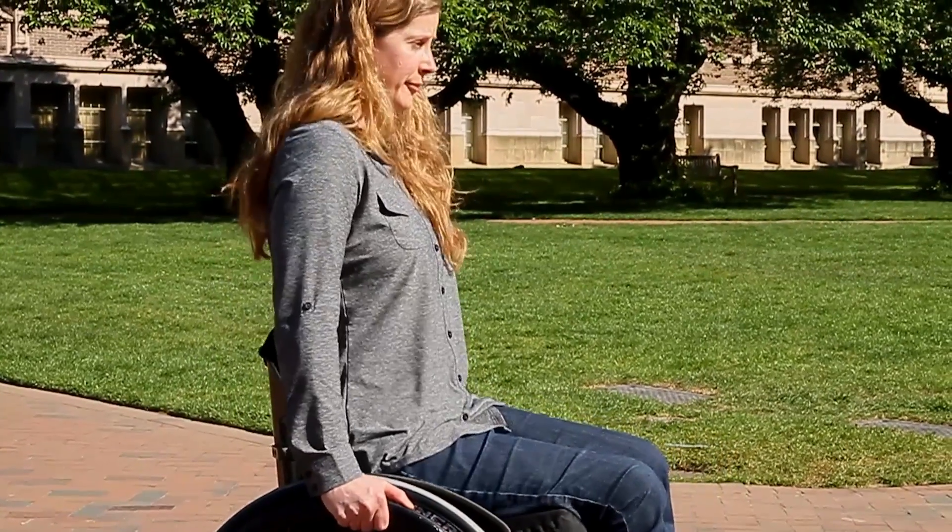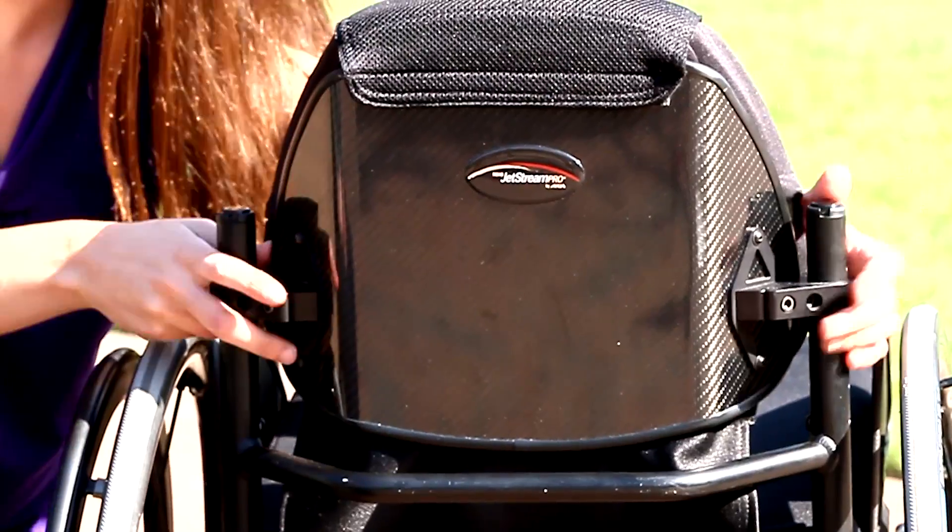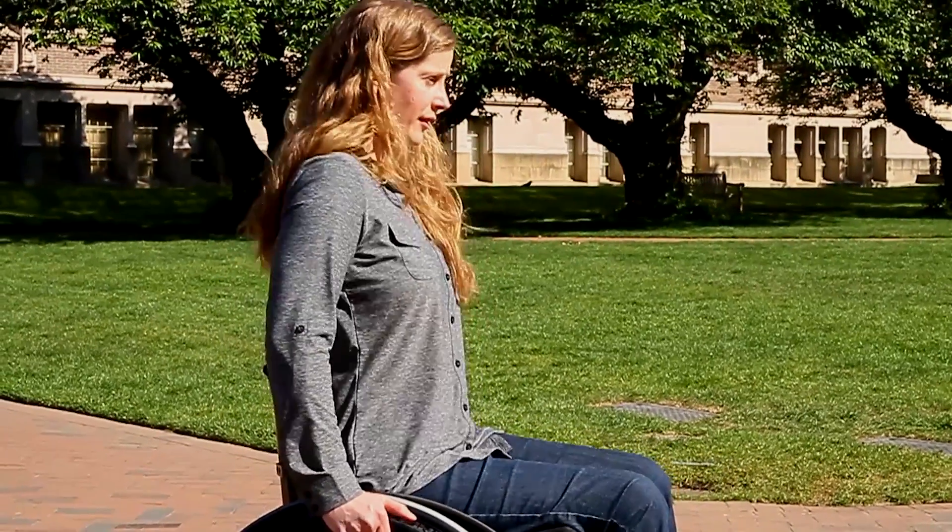If you feel unstable, have too much pain, instability, or tightness to have good posture, you may need adjustments to your wheelchair cushion, backrest, or frame to support you in a comfortable upright position.